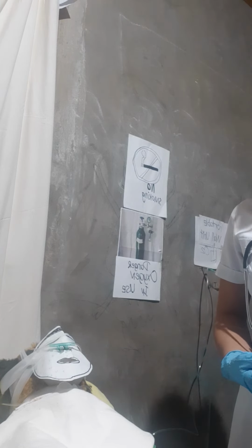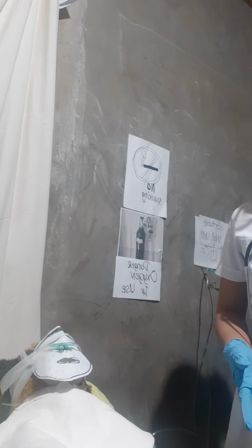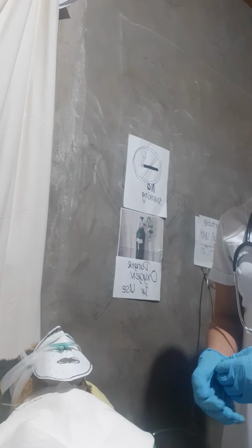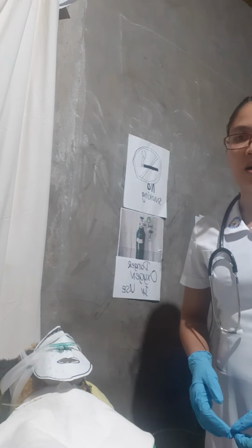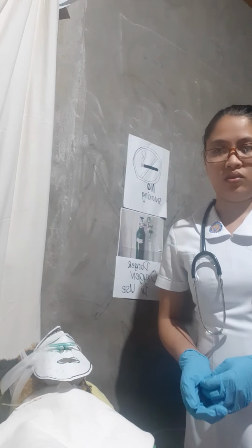It should not touch the sterile field, so that it will remain sterile, and the lubricant package also remains sterile. And afterwards, place an amount of water, and increase the patient's oxygen supplement level according to the physician's order.